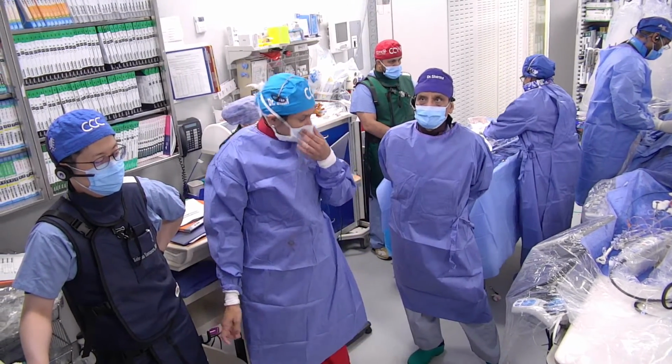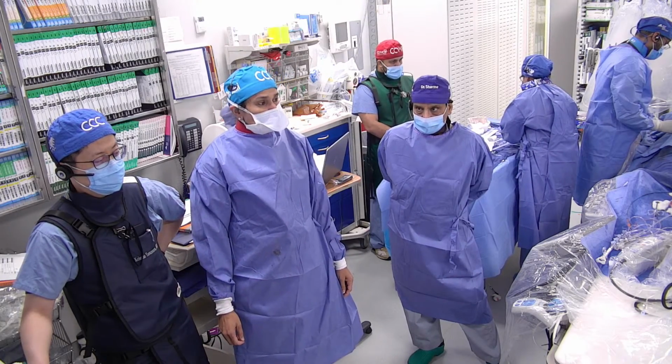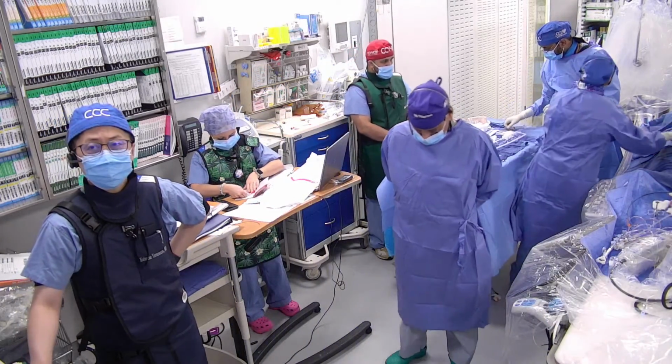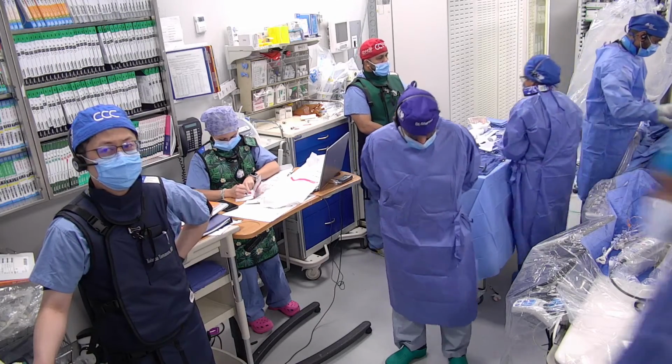That's why we went through the criteria of the dissection. So should something be done, and can it be left alone? So this can be left alone even based on imaging criteria. Right. So completely agree. Anu, before you leave, a very important question: several questions have come towards the antithrombotic.